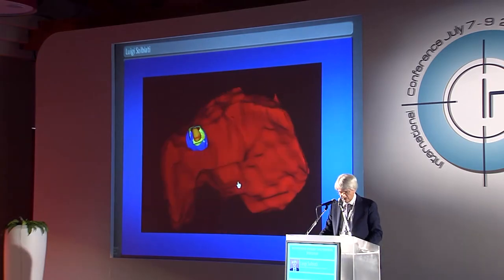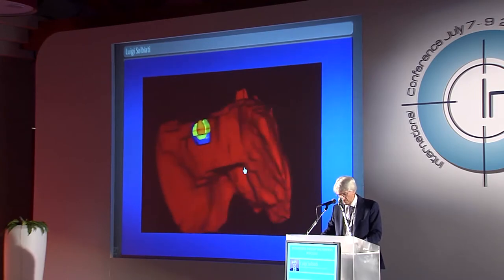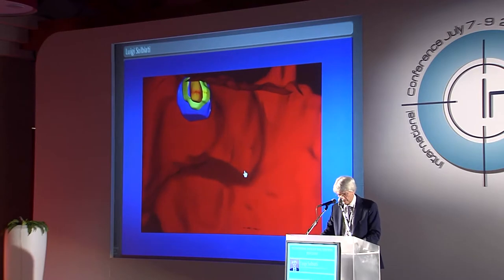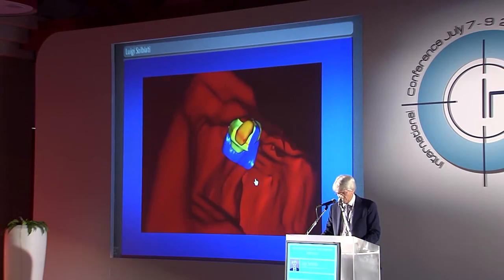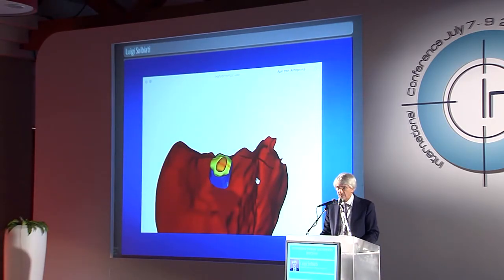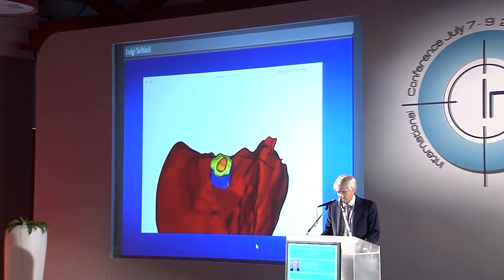This is the really close future. I think that in the next 2 or 3 years we should show all the results of our ablative treatments with microwaves, radio frequency, electroporation, whatever, only showing the lesion, the safety halo in green, and the volume of the necrosis we have achieved, and rotating in 3D, check if all the safety halo is included in the volume of the necrosis. Otherwise, the lesion is absolutely not completely treated. I invite you to be here tomorrow for the symposium, we will show you some very interesting and innovative applications of these kinds of 3D systems.